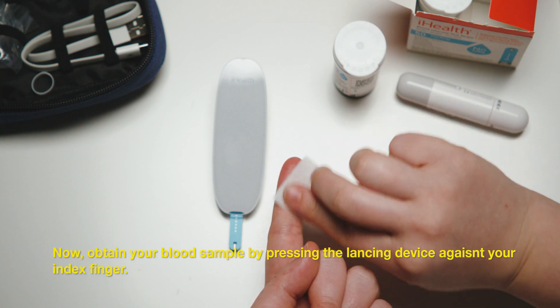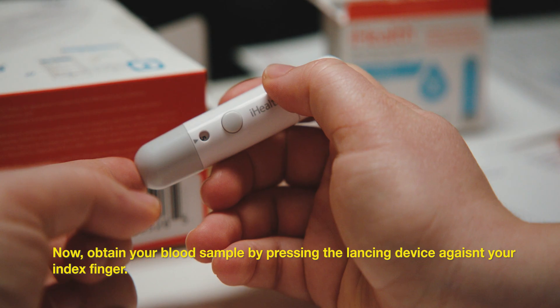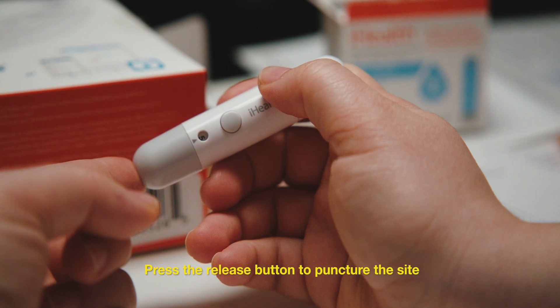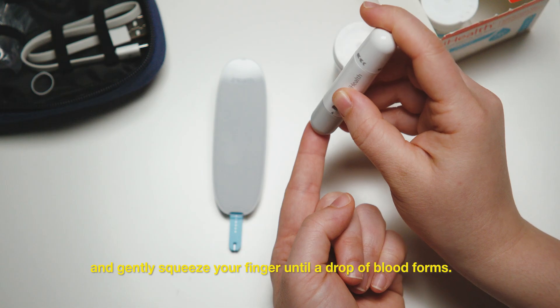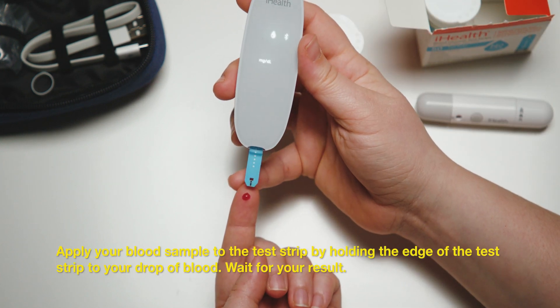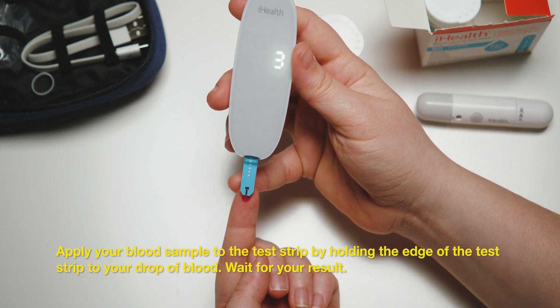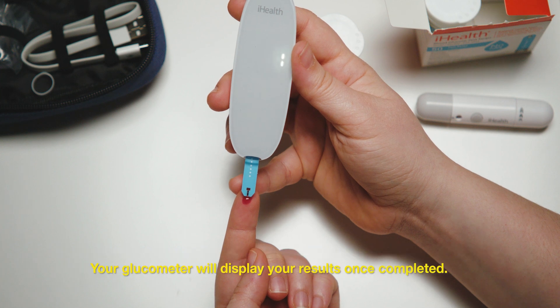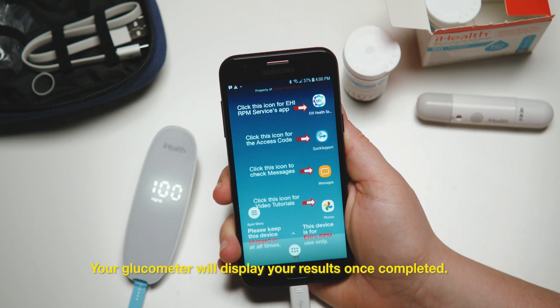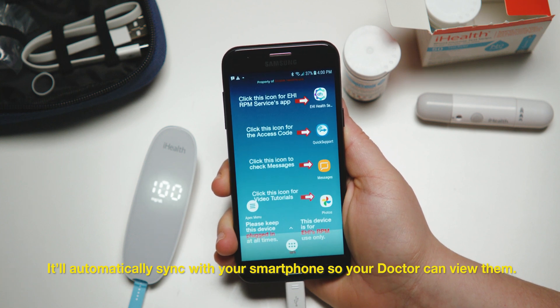Before obtaining your blood sample, clean or wash your finger. Now, obtain your blood sample by pressing the lancing device against your index finger. Press the release button to puncture the site, and gently squeeze your finger until a drop of blood forms. Apply your blood sample to the test strip by holding the edge of the test strip to your drop of blood. Wait for your result. Your glucometer will display your results once completed. It'll automatically sync with your smartphone, so your doctor can view them.